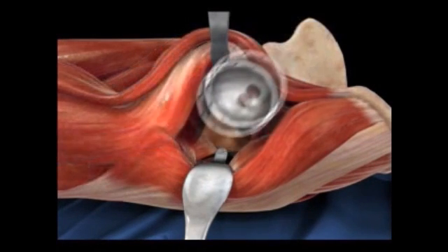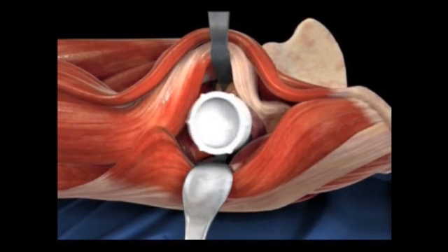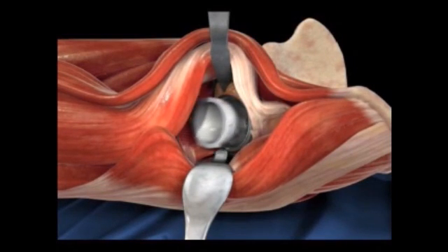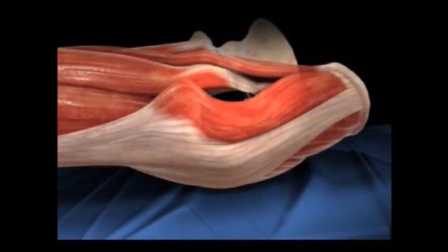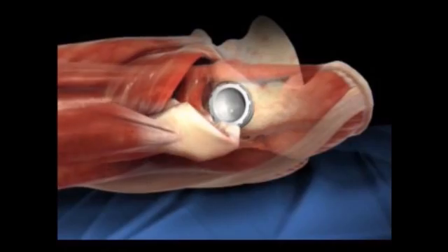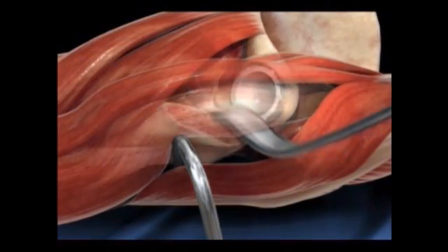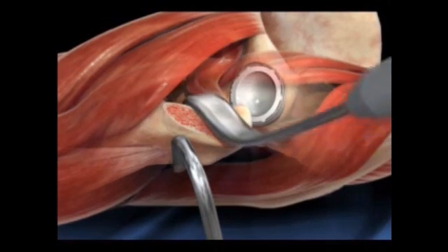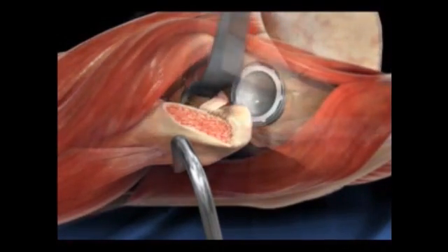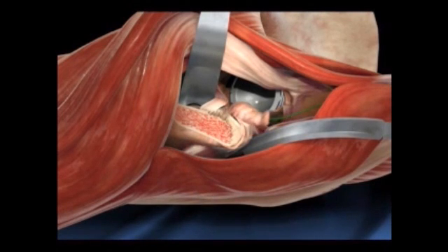With the anterior approach, is it easier to get the height and placement of the new prosthesis correct? Actually it's more precise, because we can judge the leg length and we have X-ray during surgery. Without the HANA table, it's extraordinarily difficult to do that surgery. But now with that new equipment at Providence, it makes it feasible to do this operation.